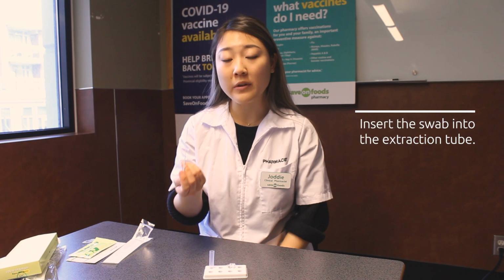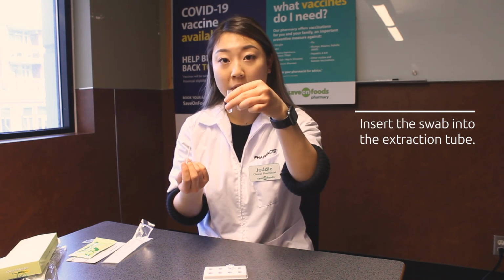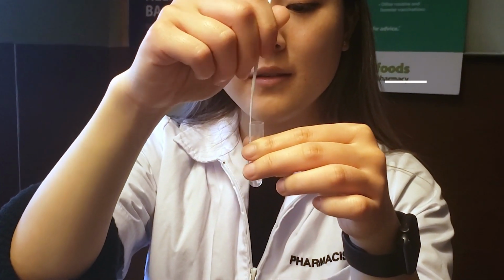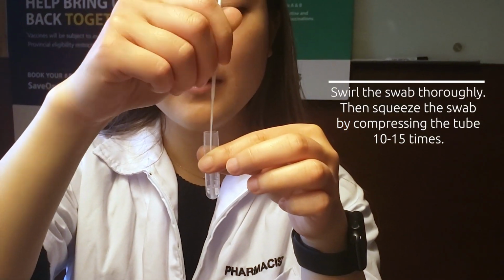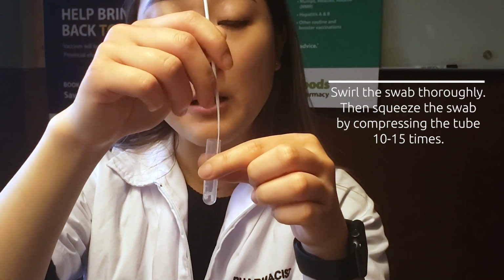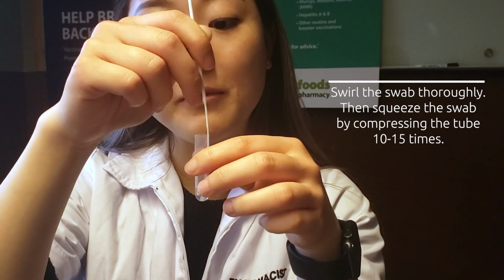Now you want to insert the nasal swab into the extraction tube with the buffer liquid inside. We're going to swirl it a couple of times, and you want to trap the nasal swab inside by compressing the extraction tube around 10 to 15 times like this.